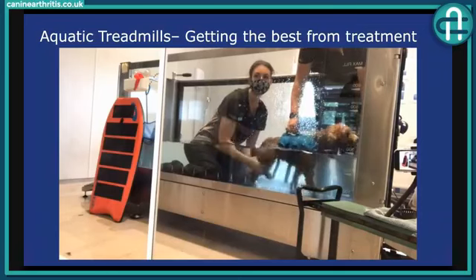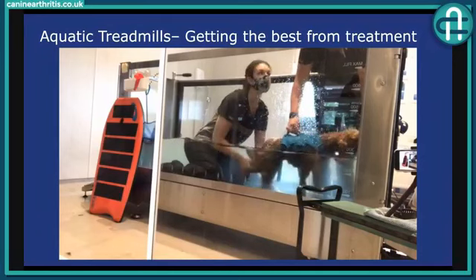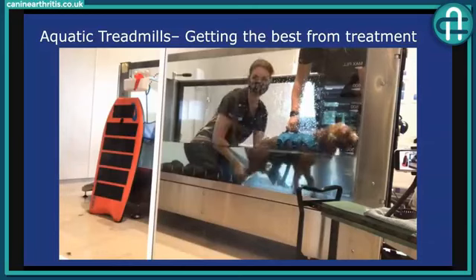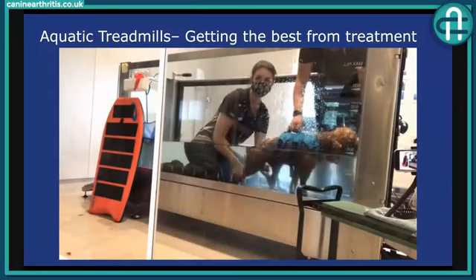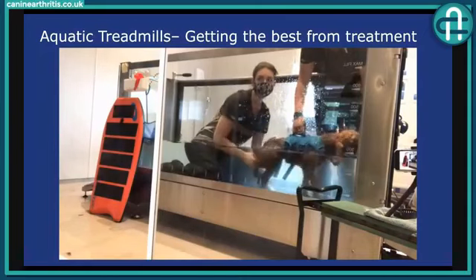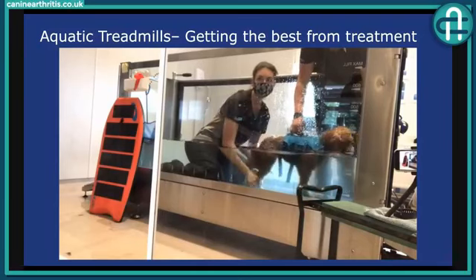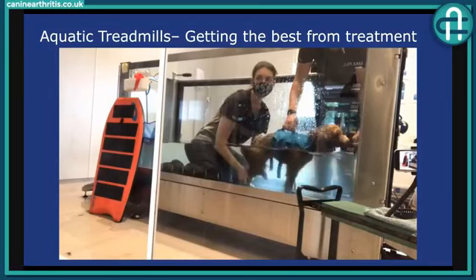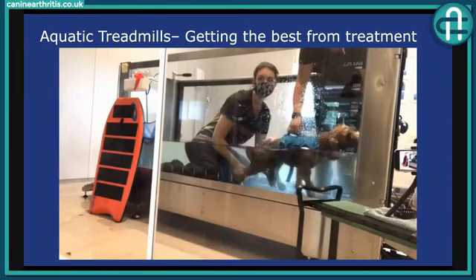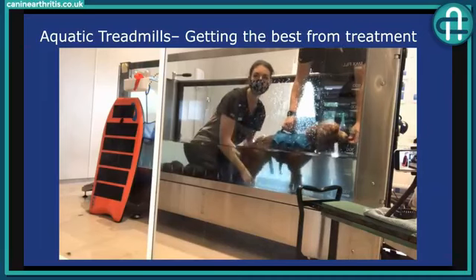Because if the treat is too high and the dog's looking up and extending its head and neck, you're going to get shorter stride length. So that can have an impact on your overall goal. If you've got the treat lower, you're going to get a longer stride length. So it can make a big difference. And some dogs lunge for a treat, so we might suggest that you place the treat outside of the chamber, so they look at it through the glass, so they can't lunge for it, which can make it a regular gait. But there's so many different things that you can do to affect the quality of the session ultimately.